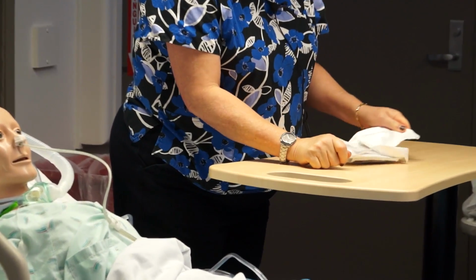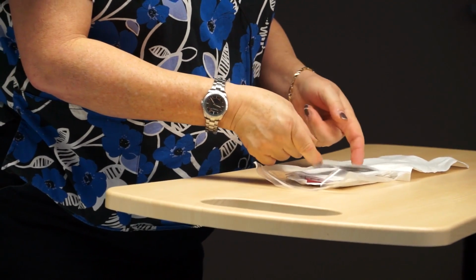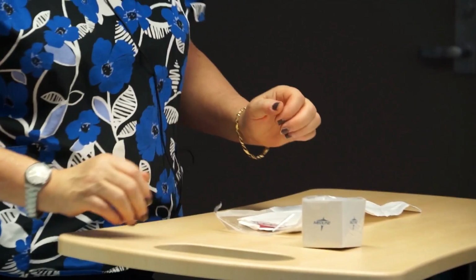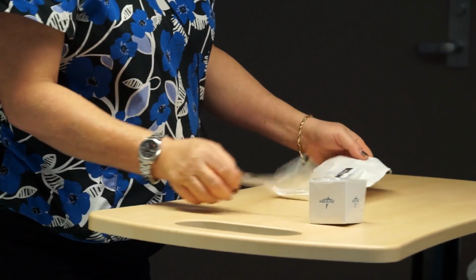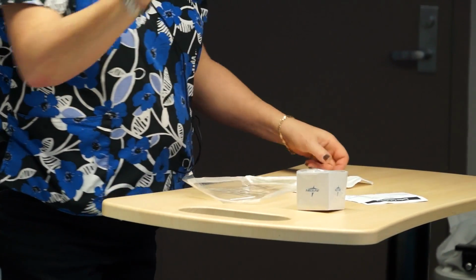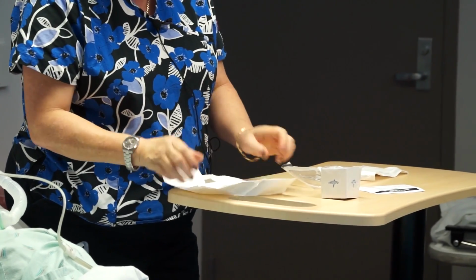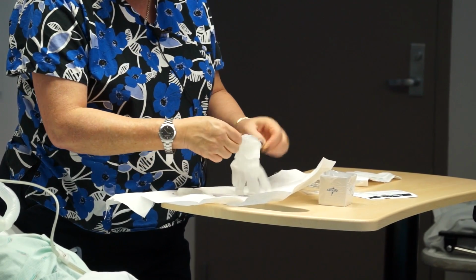So here we go. I can see that my patient needs to be suctioned. I'm going to open up my kit. At my bedside, I'm going to have one of these suction kits. I'm going to use this little cup, which I can pour my saline into. This kit happens to have 2 gloves in it; otherwise, you could use just 1 glove. So I'm going to put on my sterile gloves.